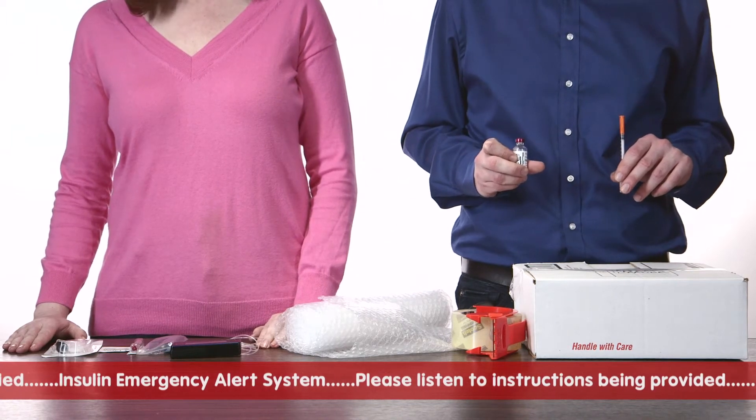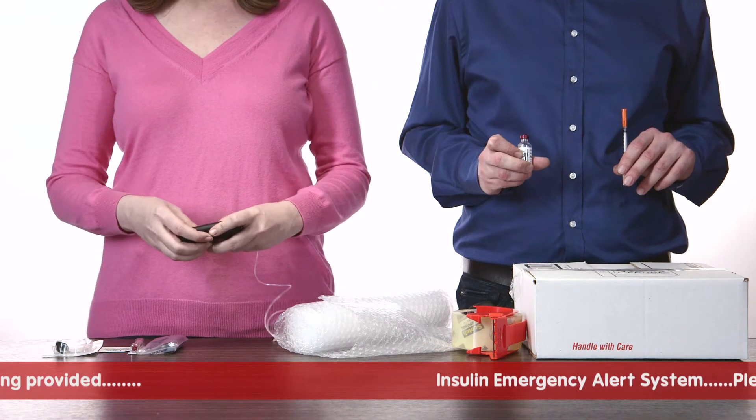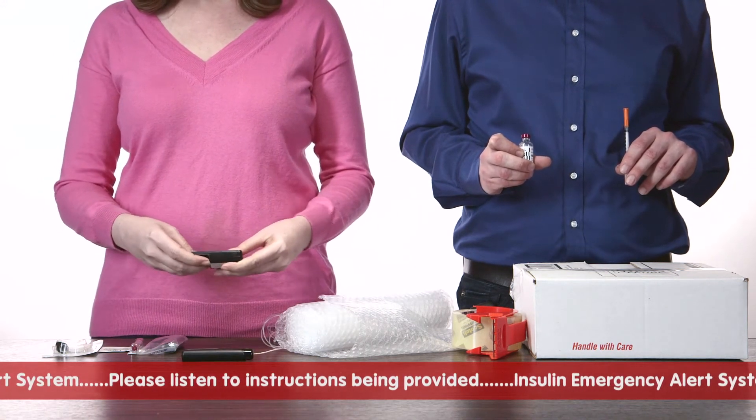If you do have a snap pump, set up your new pump body with the new insulin cartridge, snap the new pump body and insulin cartridge into your controller, and complete your setup process as usual.